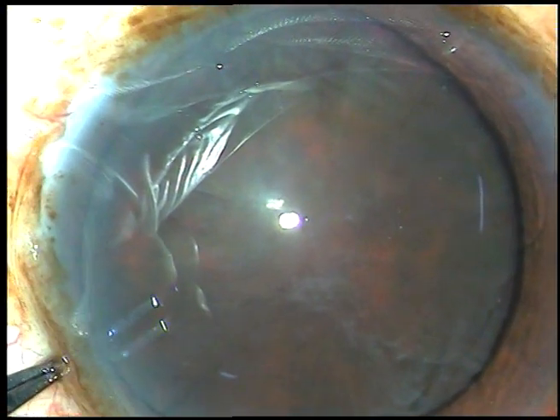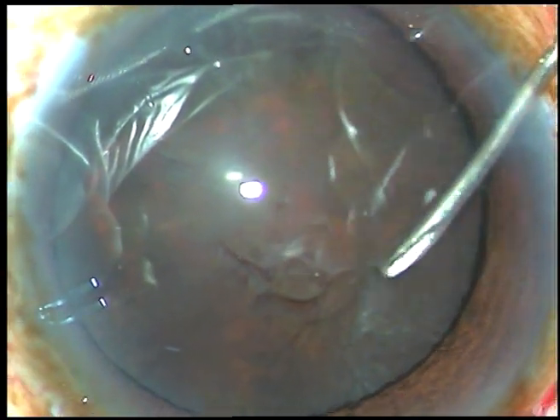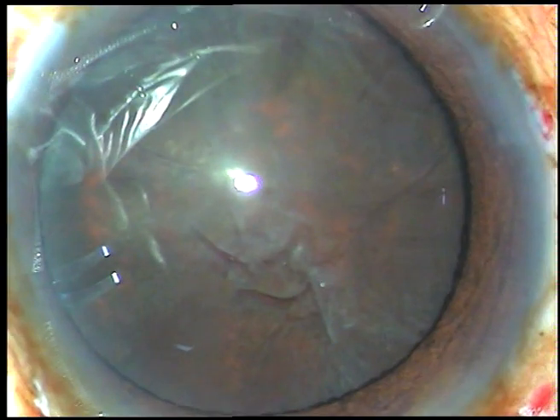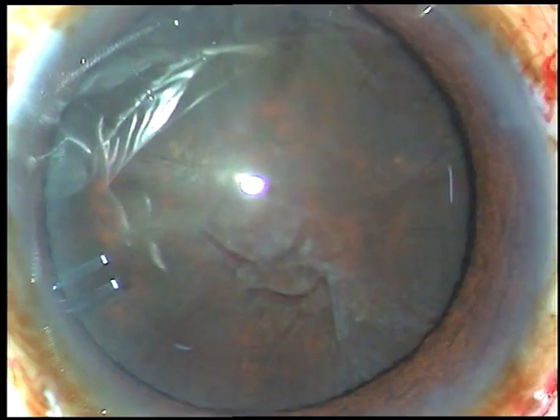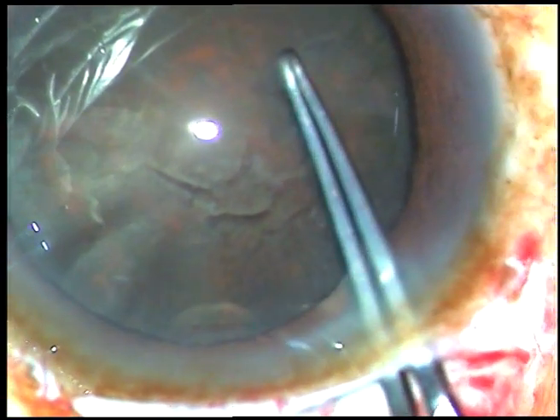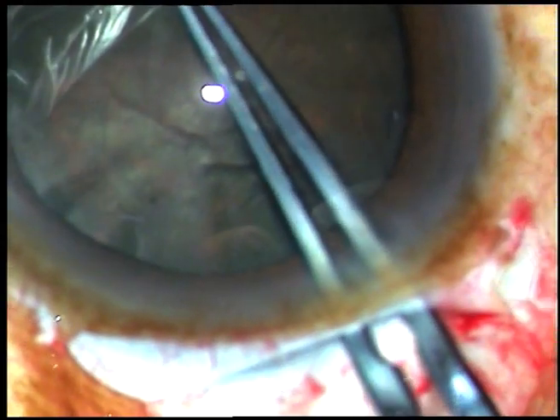Now I take a 26-gauge bent needle, incise the capsule and make a flap. Now I want to use utrata forceps. So I take a 2.8 mm keratome and enter into the anterior chamber through the right side of the tunnel. Now I hold this capsular tag, go along the margin of the pupil, and make a fairly large capsulorhexis.